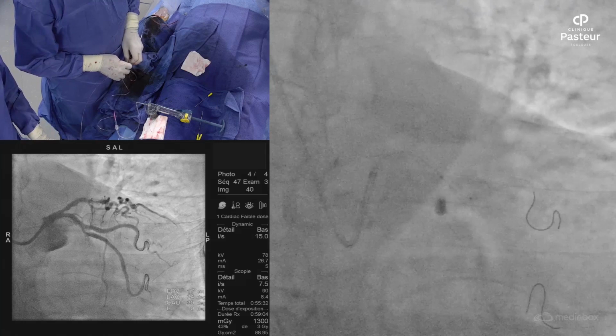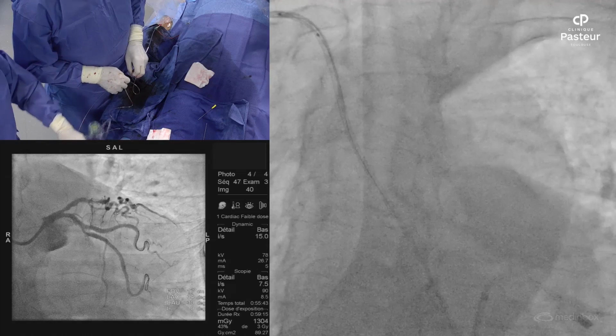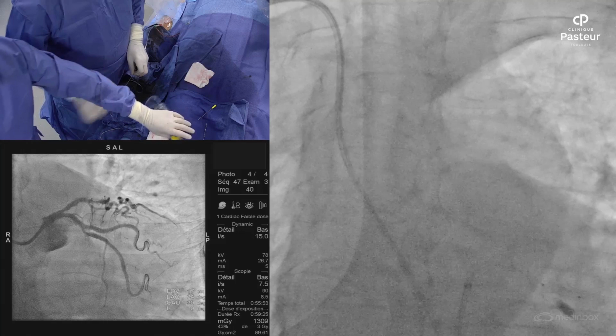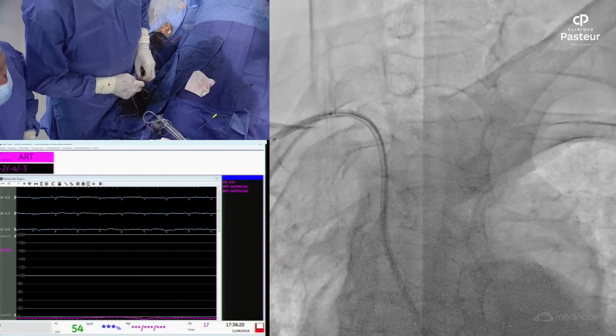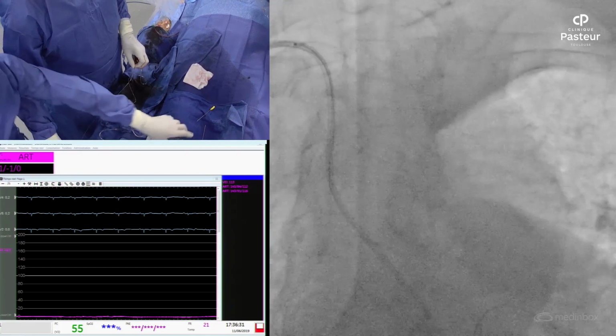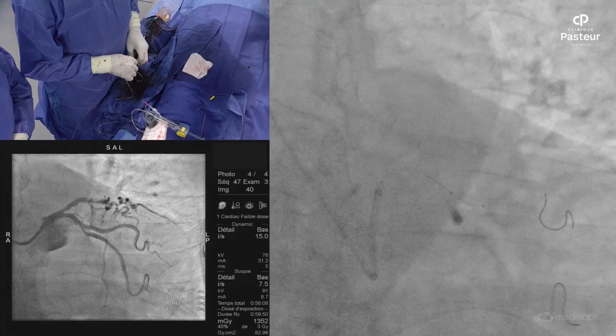So, can I see it again? So difficult. Did you deflate it? Yeah. Do you still have your stent on your balloon? Yeah. I don't know. Yes. I think so. Yeah, you see? It's here. We have the stent on now. But so what do you think? Deflate the balloon. It's deflated already. You remove first the stent, leaving the wire in place. Yeah. But then what to do?